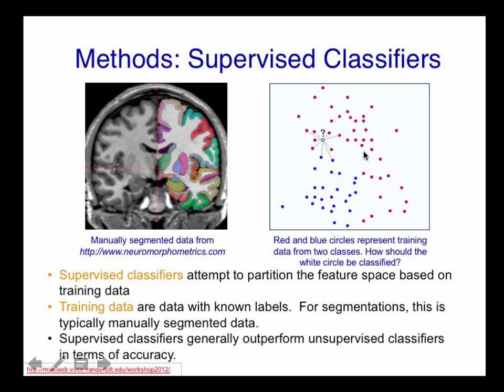Okay, so with something like this approach of the nearest neighbor, this is called the k-nearest neighbor. So it's a very common machine learning classifier. And you might want to think about, where would I not want to use that? Is there a reason why I wouldn't want to use this, or I wanted to use a different approach? Well, in this case, we have a lot of neighbors near the voxel that we're trying to classify, right?